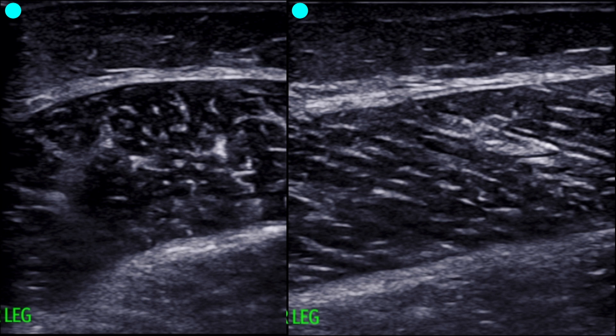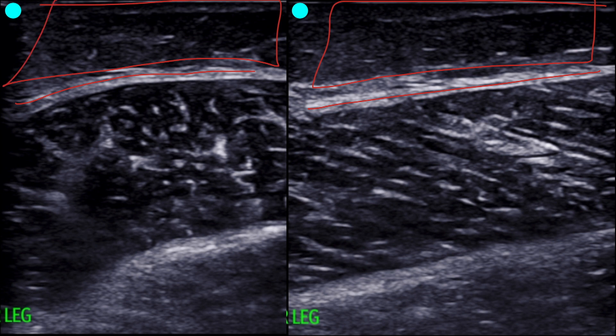This is her normal right leg posterior — the same images we've been looking at throughout these lectures. We can see the fascial plane right here and then her normal subcutaneous tissue. This one is a transverse view and then this one over here is a long axis.